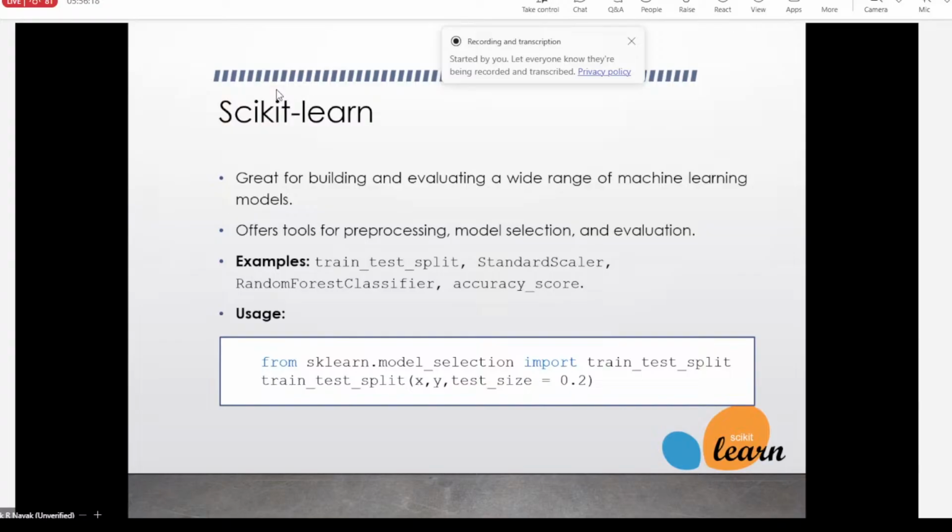In my last lecture, I already talked about the overall structure of a machine learning based CAD system, where we have seen there are multiple stages, right? Starting with pre-processing, followed by ROI segmentation, then feature engineering, and then something called the classification stage. In the classification stage, of course, we have to use the scikit-learn library, or else if you want, you can also write the code from scratch using the traditional Python programming language.